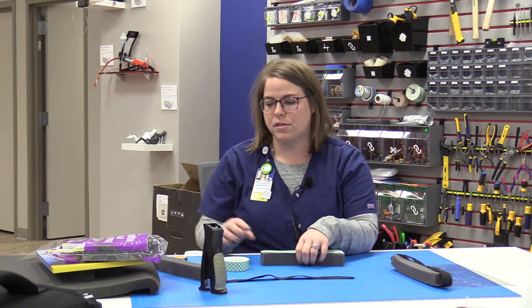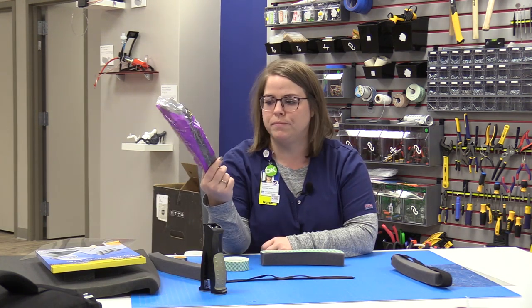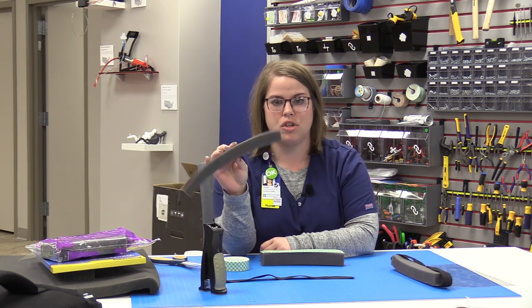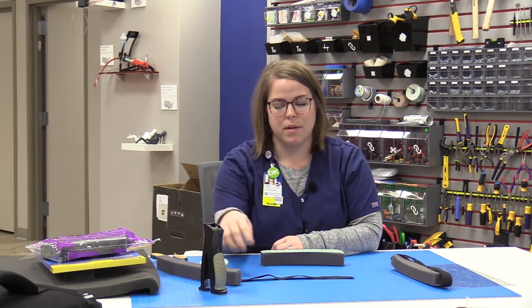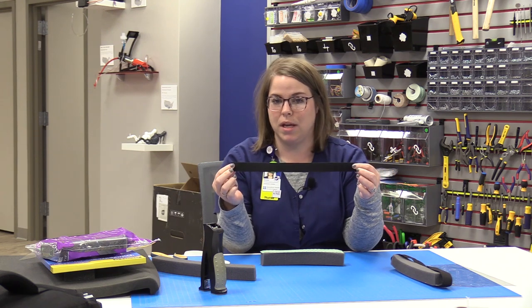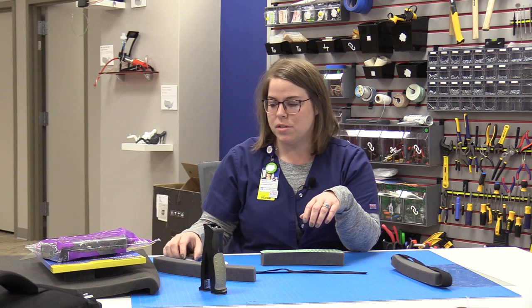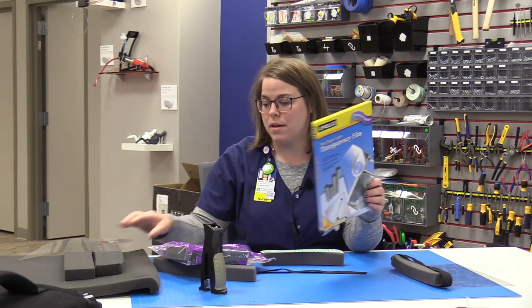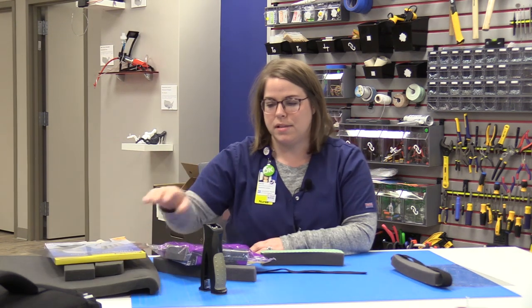The materials you're going to need are the air conditioner foam weatherseal — just a one by one-ish block of foam — some double-sided foam tape, some elastic (doesn't matter how wide; this happens to be an inch, about 15 inches), some scissors, transparency film, which is a clear piece of plastic, and then a stapler.